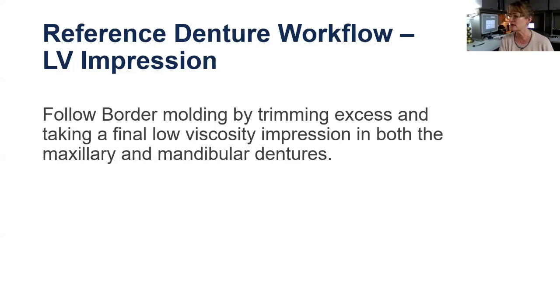But what we experience is over retracting of the lips and cheeks. So one, I implore you to utilize four-handed dentistry, right? It's either the assistant is assisting the dentist, or perhaps it's two assistants working with the patient. But when you're retracting the lips and cheeks, you're going to most probably utilize some sort of ancillary item. It could be a plastic mirror. We want to avoid metal because of light reflection. You could utilize a tongue depressor. Tongue depressors work really well.